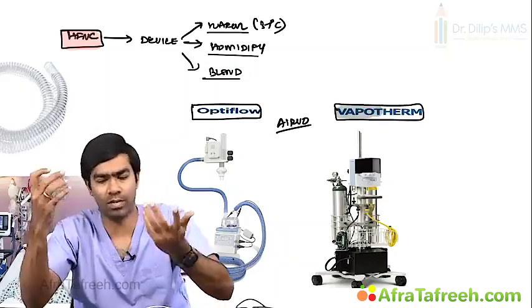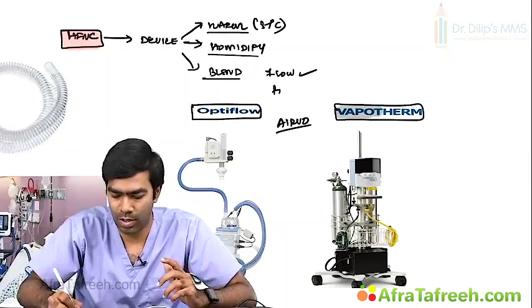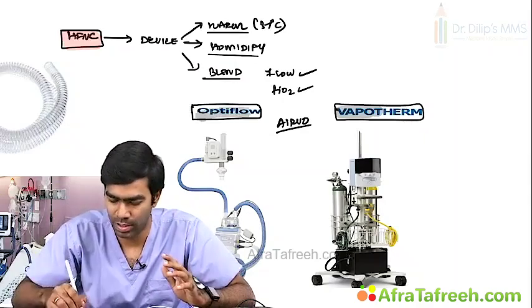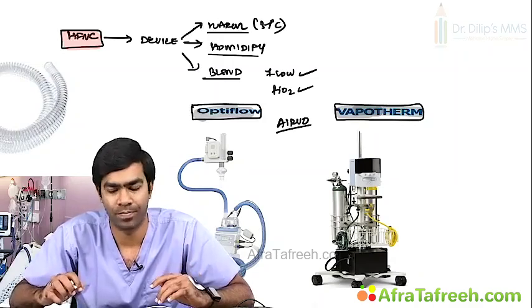So it can deliver whatever flow you want to set and at whatever FiO2 you want to give, these devices can do that. That's why you need these special devices to deliver this high flow nasal oxygen.